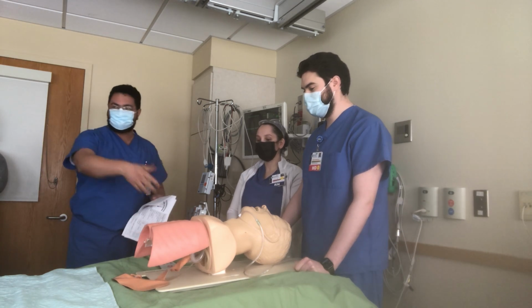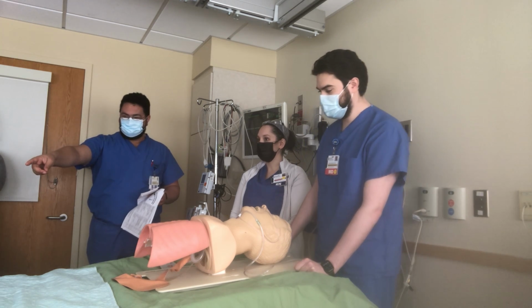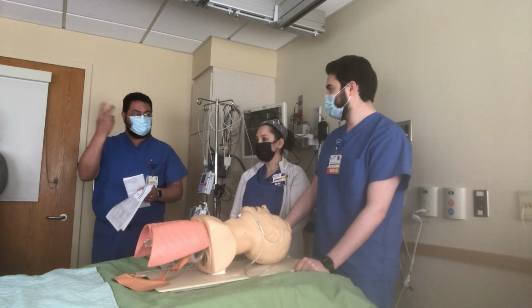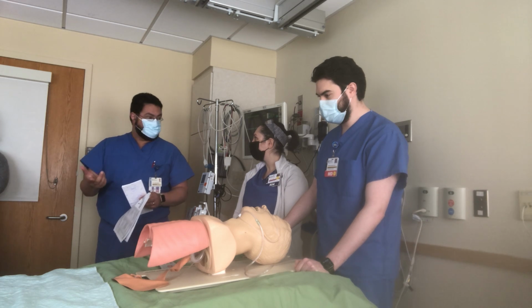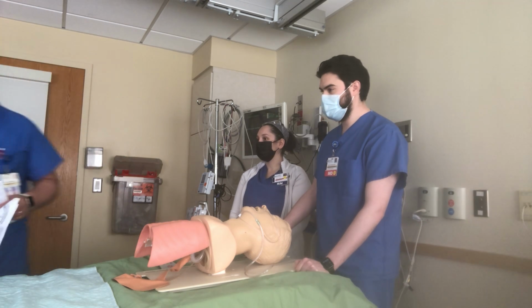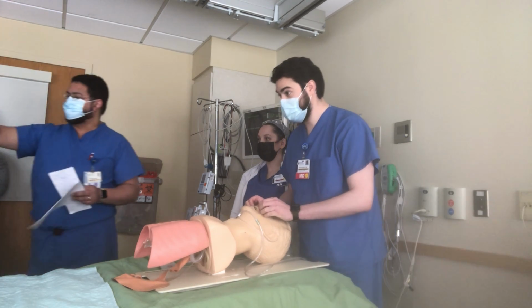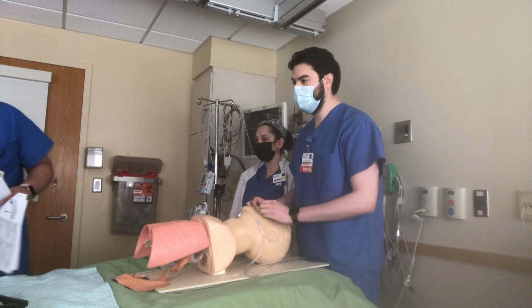If we're gonna go with a glidoscope, we have to have a bougie. If we're going with the regular laryngoscope, we're gonna have a glidoscope as at least one backup method available in the room. And then the A is for airway, so we have to have oral airways. We're gonna find all of these things.